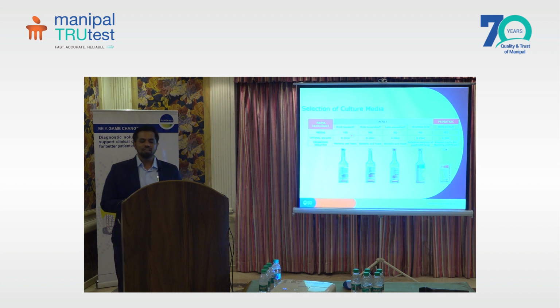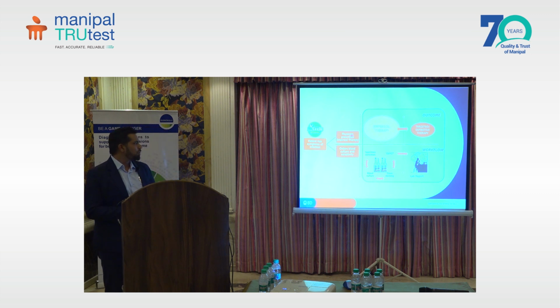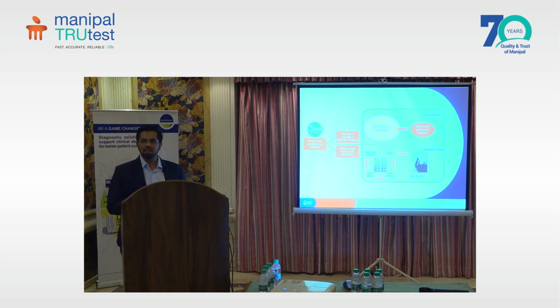So to overcome the challenges in blood culture, such as delayed and reduced recovery, patients who are already started on empirical antibiotic therapy, so their constant antibiotic is already present in the blood, and this might hamper the recovery of the bacteria also. Low volume withdrawn, isolation of molds and mycobacteria. So these are the challenges which are faced with the conventional blood culture. As I said, when the patient comes into the emergency, or is already in the ward, the patient comes with the symptoms and is started on empirical antibiotic therapy, and the blood culture is ordered.